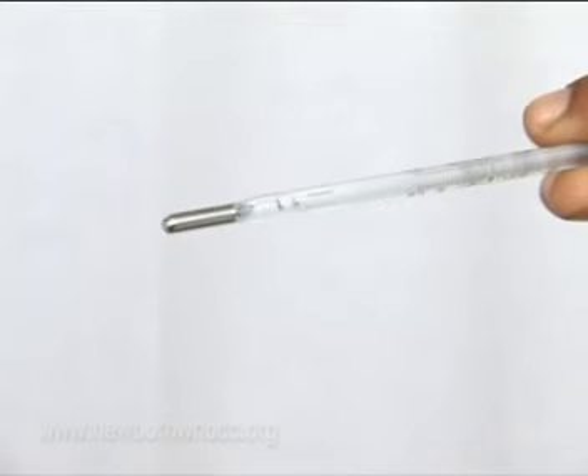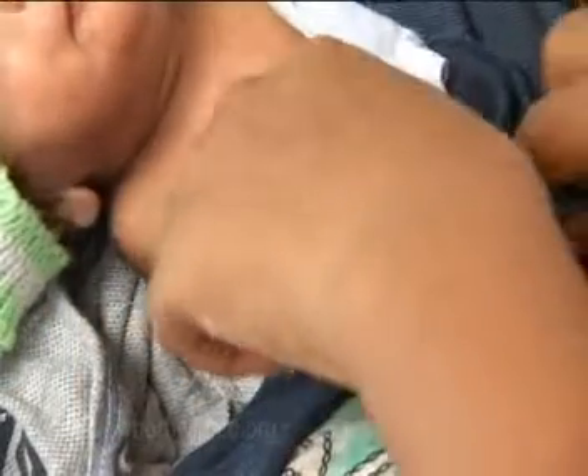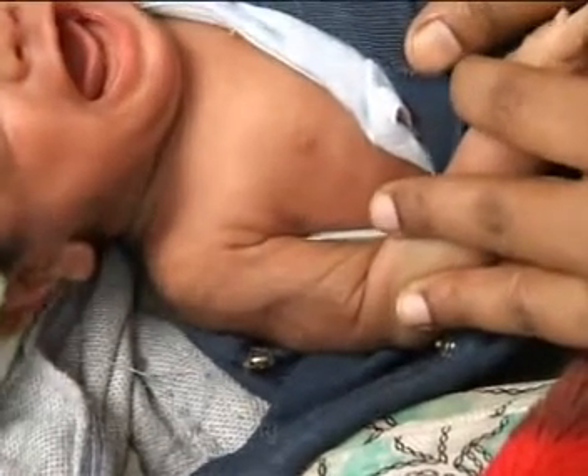Gently hold the baby's arm against the body and keep the thermometer in place for 3 minutes. Remove the thermometer and record the temperature. The temperature of this baby is 37 degrees Celsius.